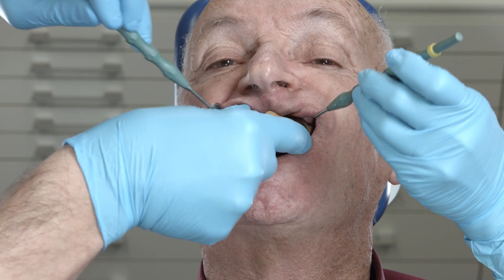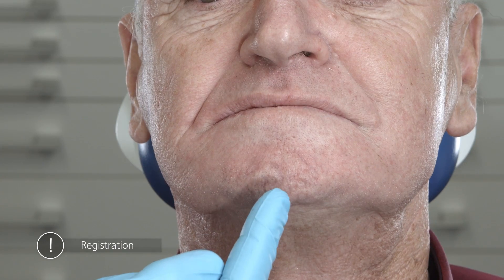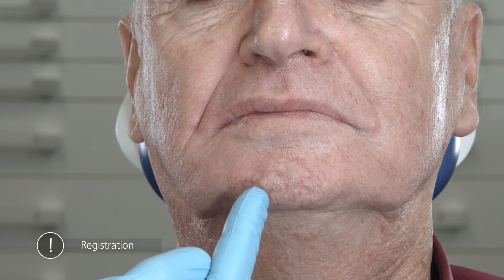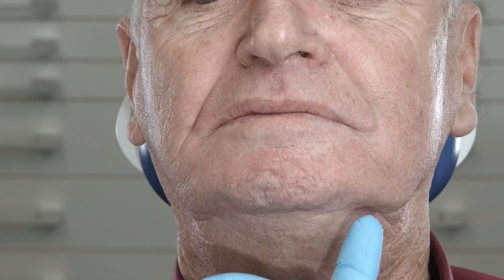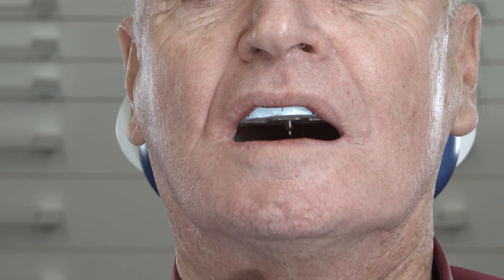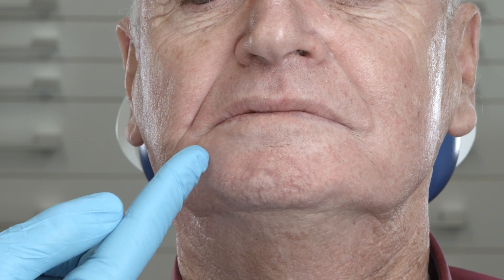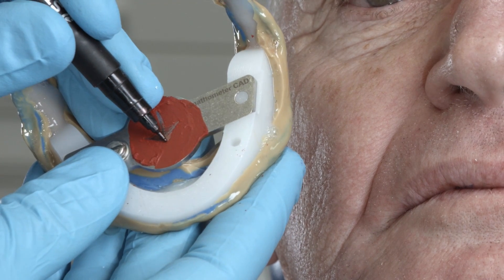Inform the patient about the possible risk of injury before you insert the two impressions together with the mounted Nathometer CAD. The tongue of the patient must not enter the space between the plates while the patient does the biting exercises. The patient carries out protrusive and laterotrusive movements to the left and to the right. You can guide the patient by indicating the direction of the lower jaw movements with your finger. The movements should be repeated three times in each case. When the direction is changed, the patient opens his mouth, swallows, and then closes the mouth again. When a clear arrowhead or gothic arch is visible, remove the 3D bite plate from the upper jaw to record this position. If this is not the case, the tracing procedure has to be repeated.